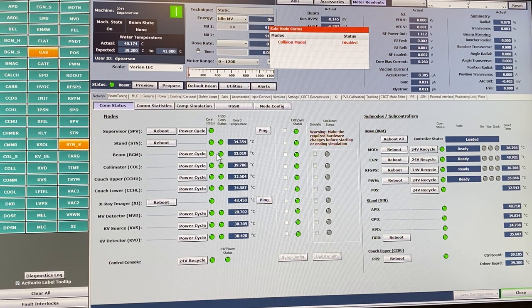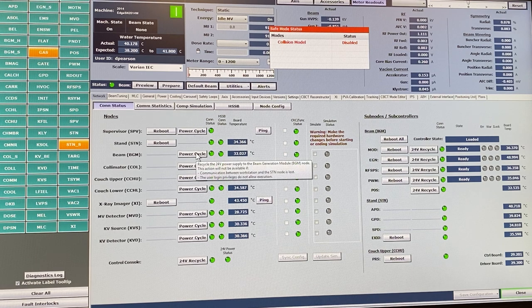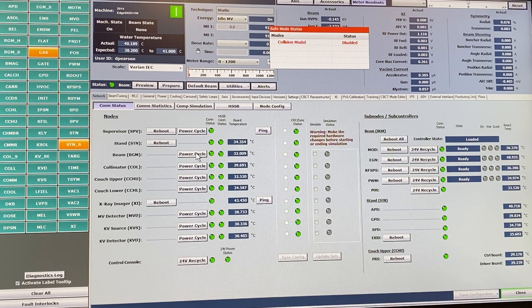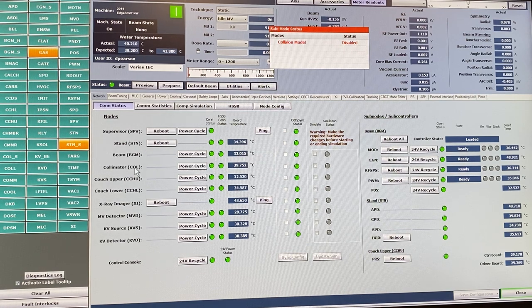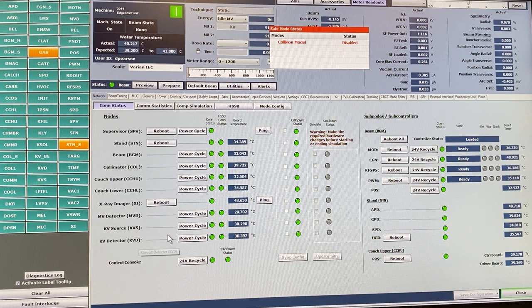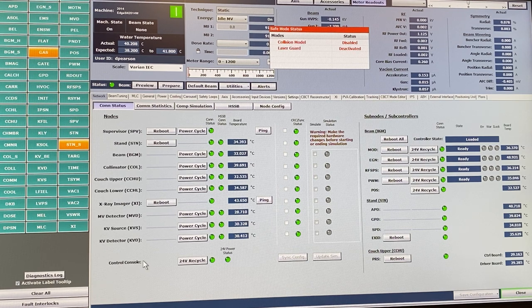BGM stands for beam generation module. If a fault starts with the letters BGM followed by a series of letters and numbers, that indicates a problem that could be fixed by rebooting the BGM. STN is the stand — we have the collimator, upper couch, and lower couch. The XI system handles imaging, and for mechanical components like the MV detector panel, the KV detector panel, and the KV source, you can individually reset those.